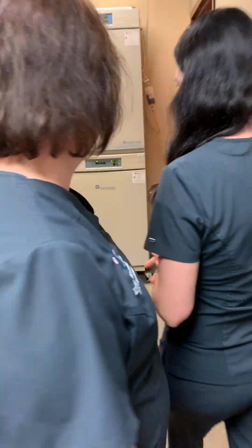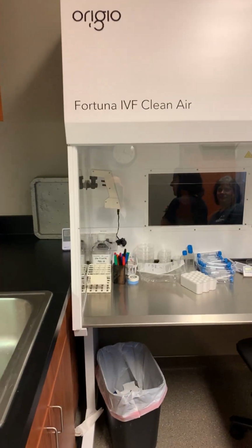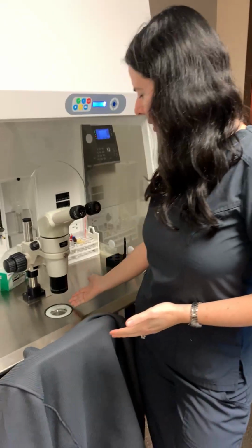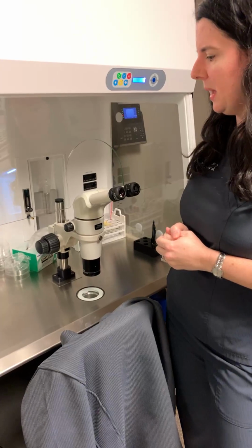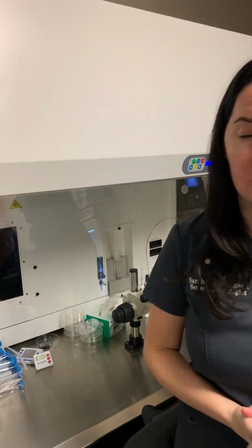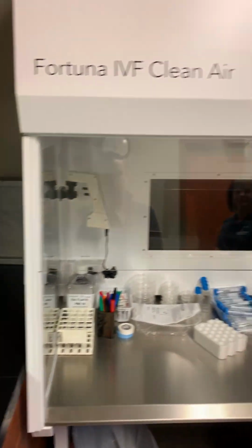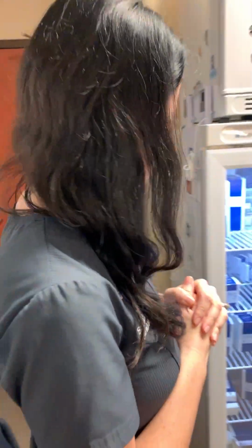We also got new incubators last month that we're very excited about. Do you want to see them? Sure. We've got quite a bit of new stuff in here actually. We've got a new hood, which is very exciting. And what's the importance of the hood? The hood is so that we can handle the embryos under this microscope in a sterile fashion. And so we've got our own workspace. It's got a filter running at all times to keep everything in it clean. We have one in the inner lab, but it just was not enough space. We're big enough now that 2 people needed to work at the same time.